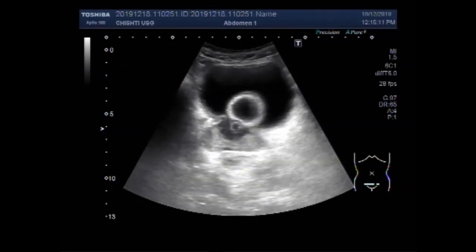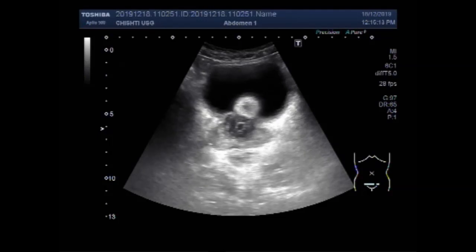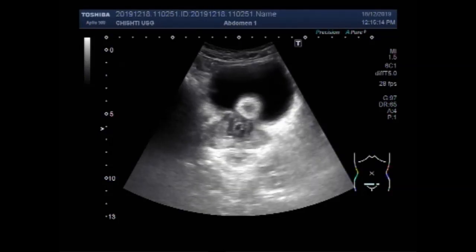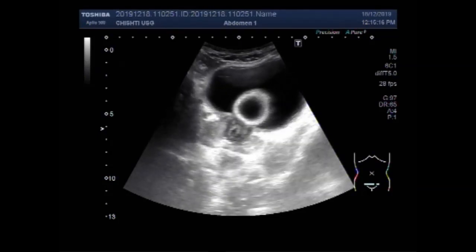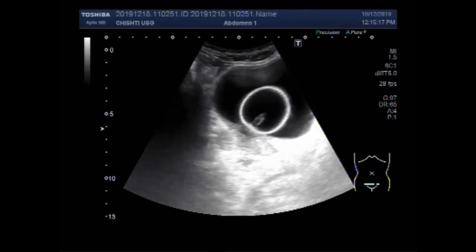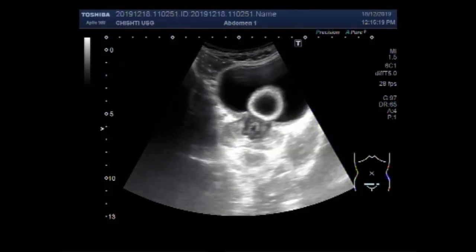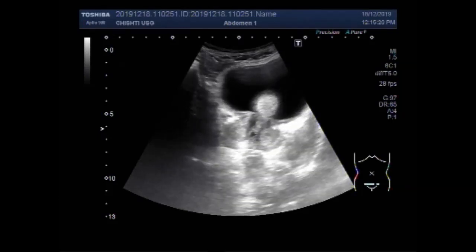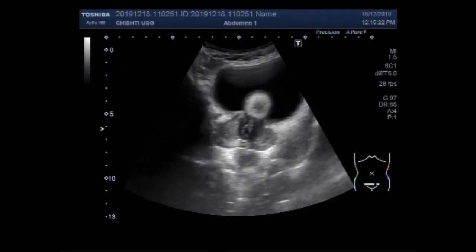The normal bladder wall has a mean thickness of 2.76 millimeters when the bladder is almost empty, and 1.25 millimeters when it is distended.